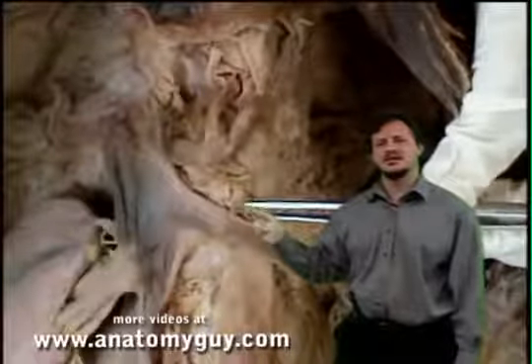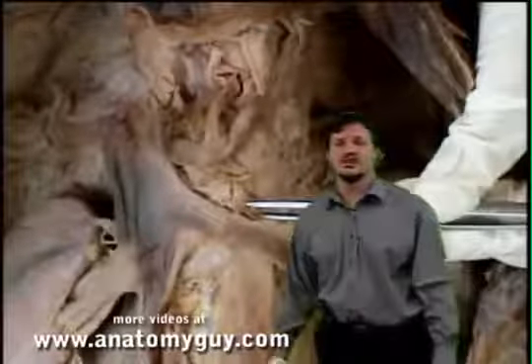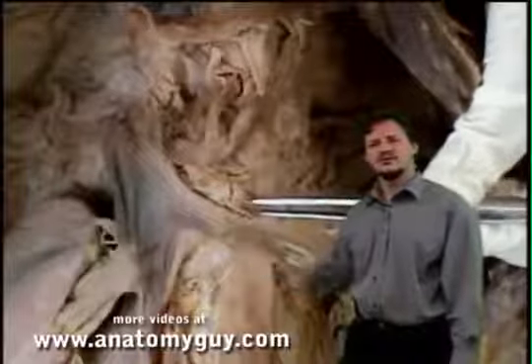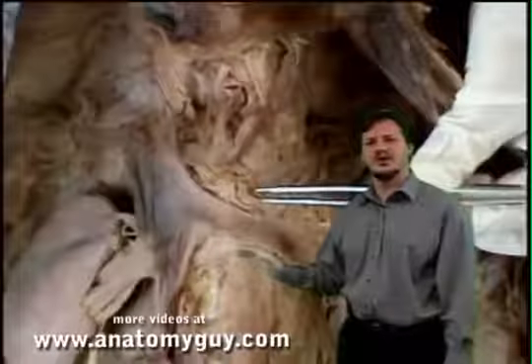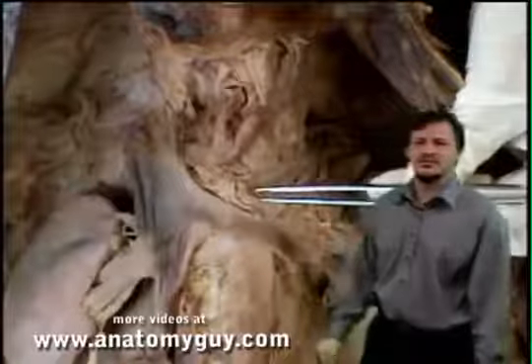This is the superior mesenteric, and remember, it's supplying all of the midgut structures. It's crossing over the left renal vein at this location, so if there's an abdominal aneurysm at this point, it can create that nutcracker effect that you may have heard of.